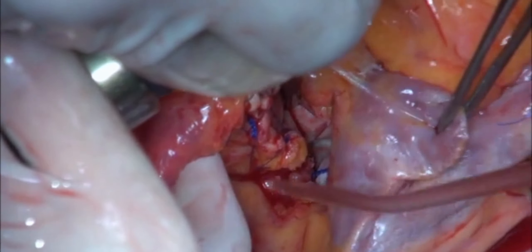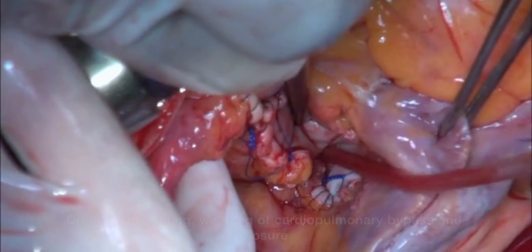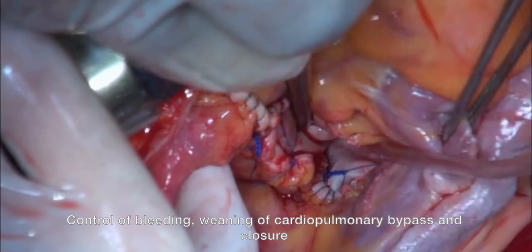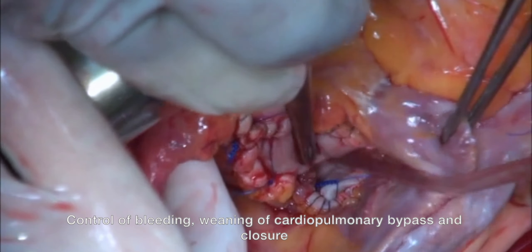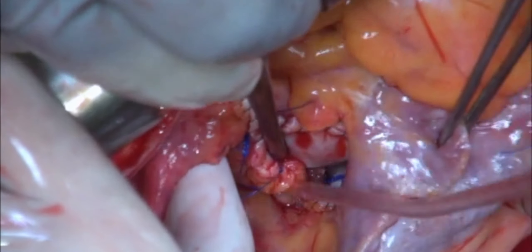Finally, we performed weaning from cardiopulmonary bypass, control of bleeding, and closure.